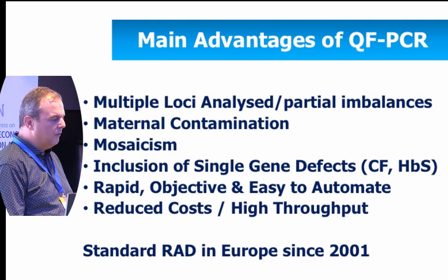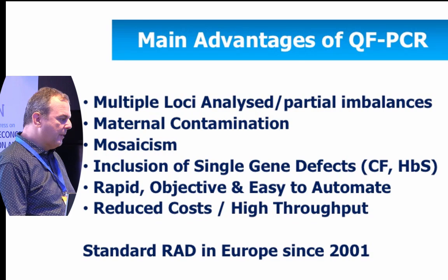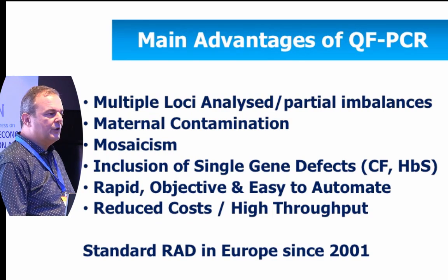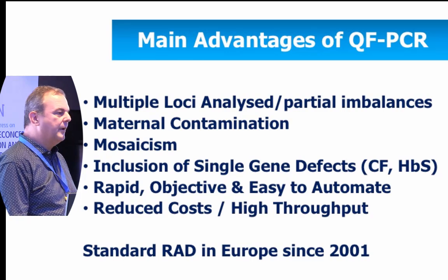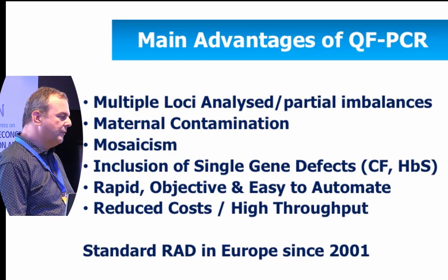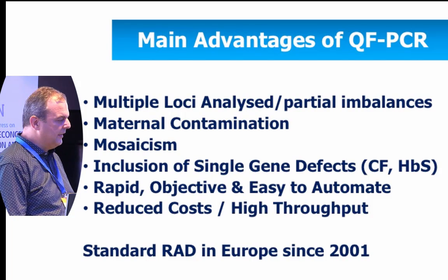For molecular tests, you can include single mutations in the same PCR if you want. It is rapid, objective and automatable, which allowed reduced cost and high throughput, and it has been the standard of care in most laboratories in Europe, and I have to say almost everywhere in the world apart from the United States, since 2001.